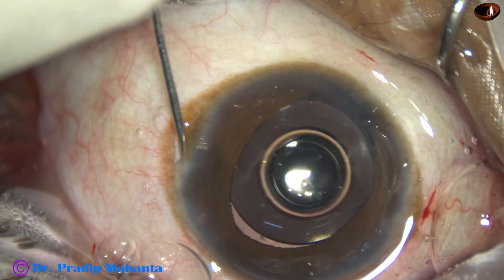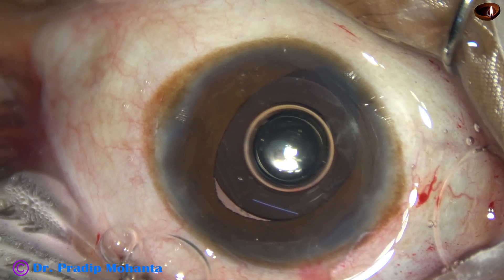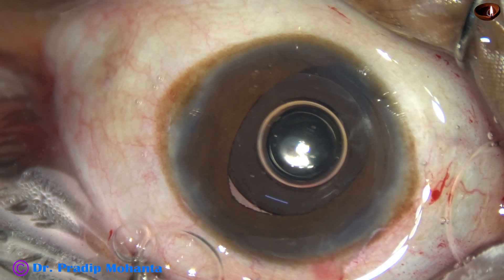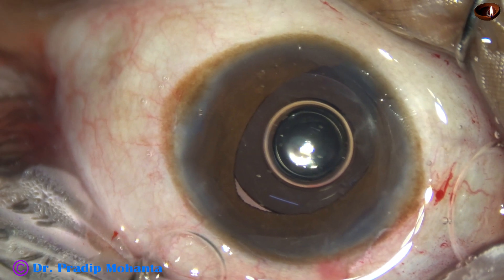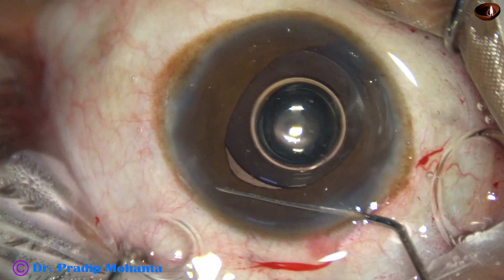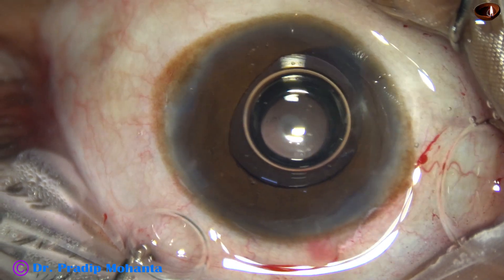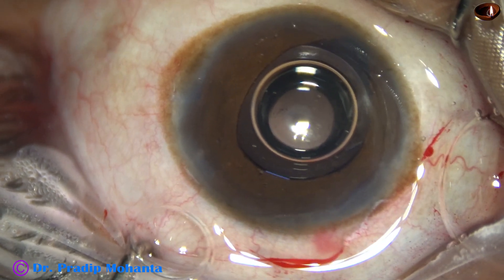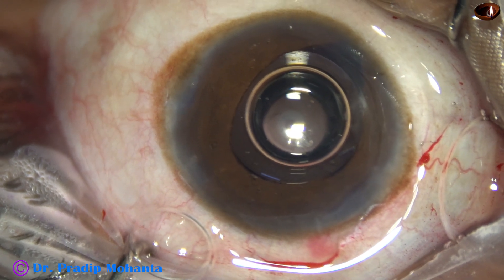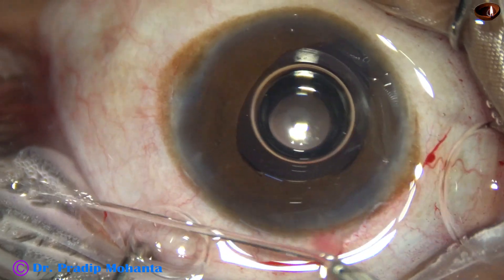This is closure of the side ports. There were two side ports — on the left side one very small side port which I made later for introduction of the chopper, because the original side port was quite far, about five clock hours from the main side port. I just touched the iris with the Sinskey hook and now the pupil has constricted. This is coloboma, so we cannot get the iris at 7 o'clock — this is the left eye of the patient.